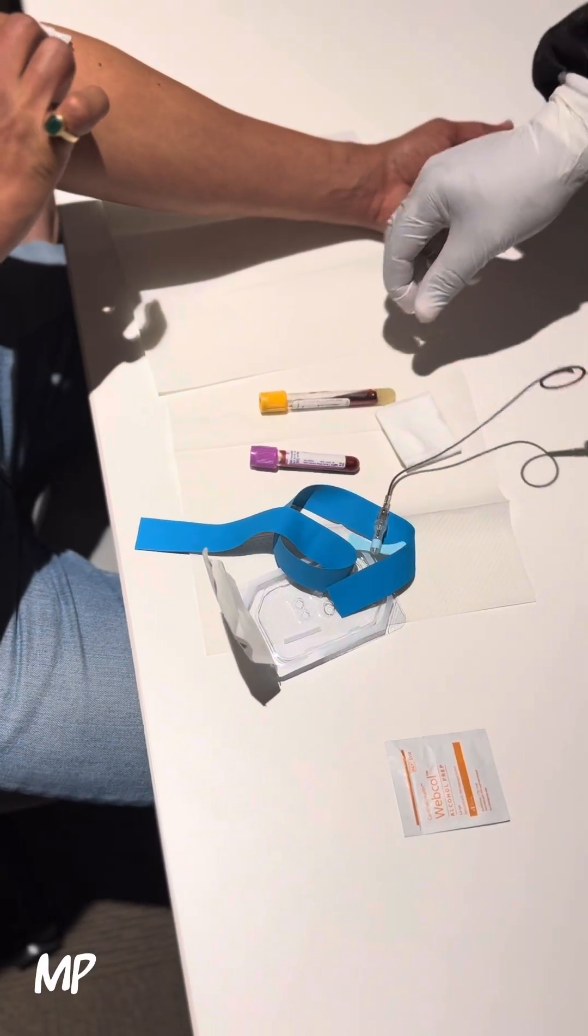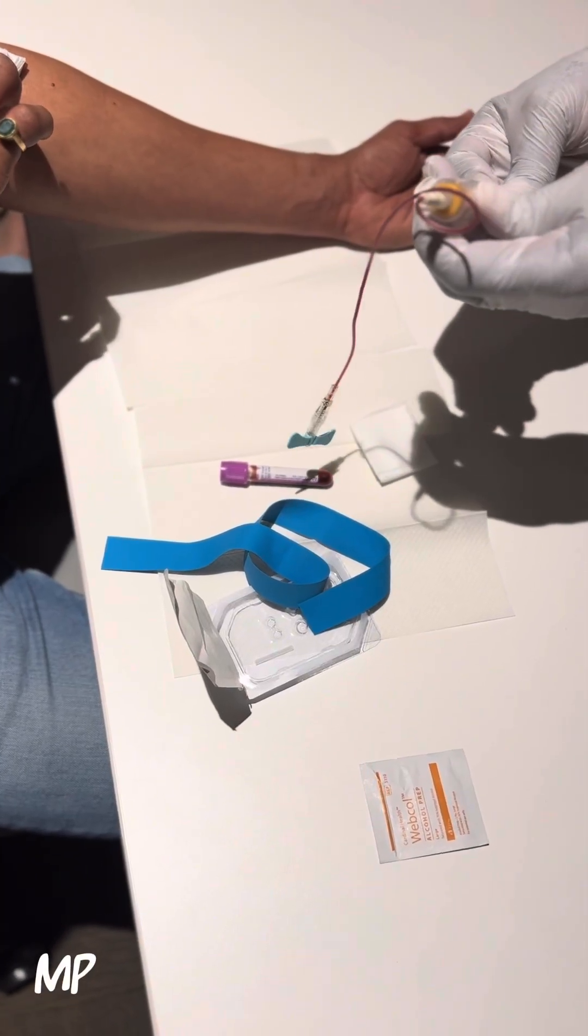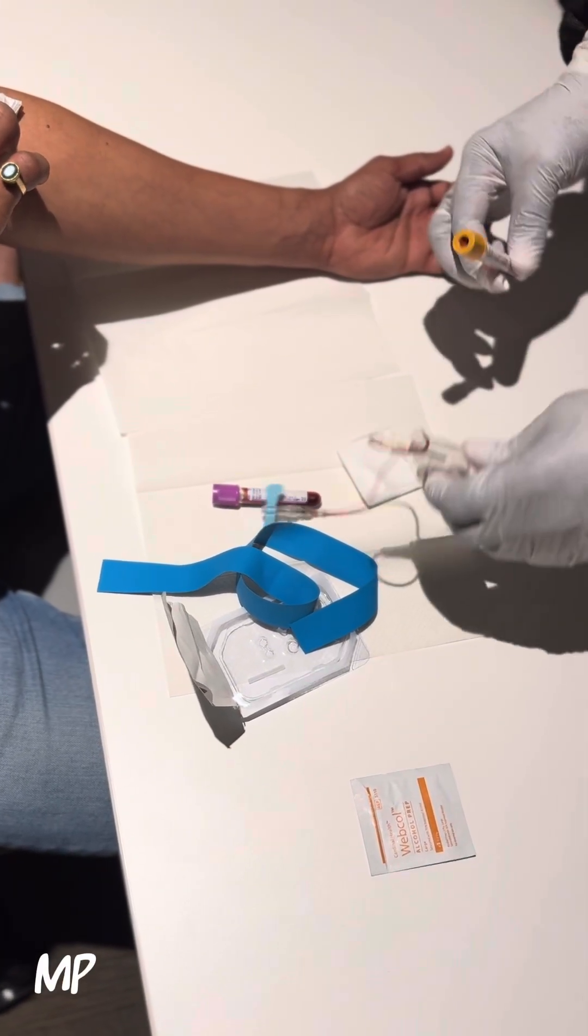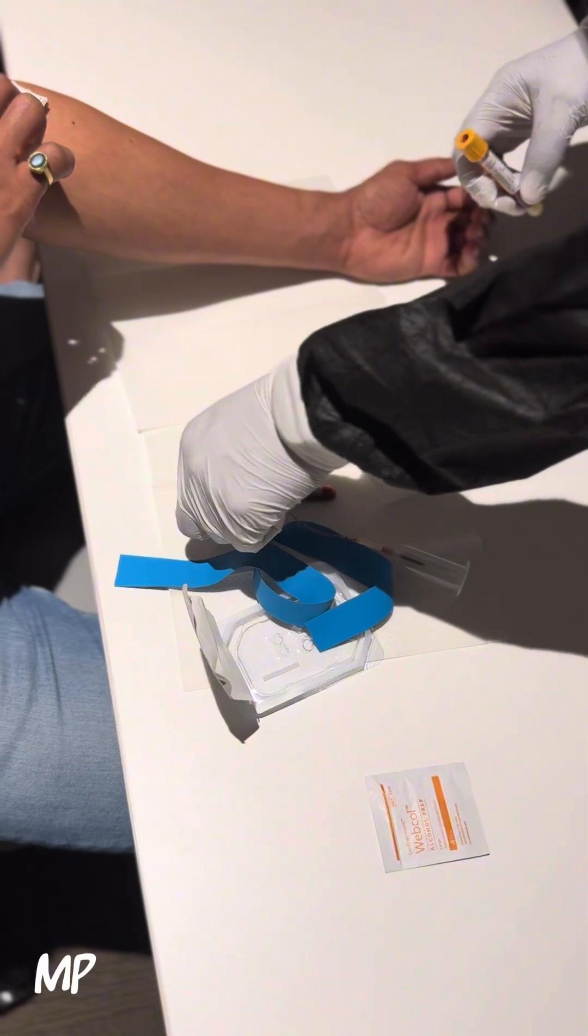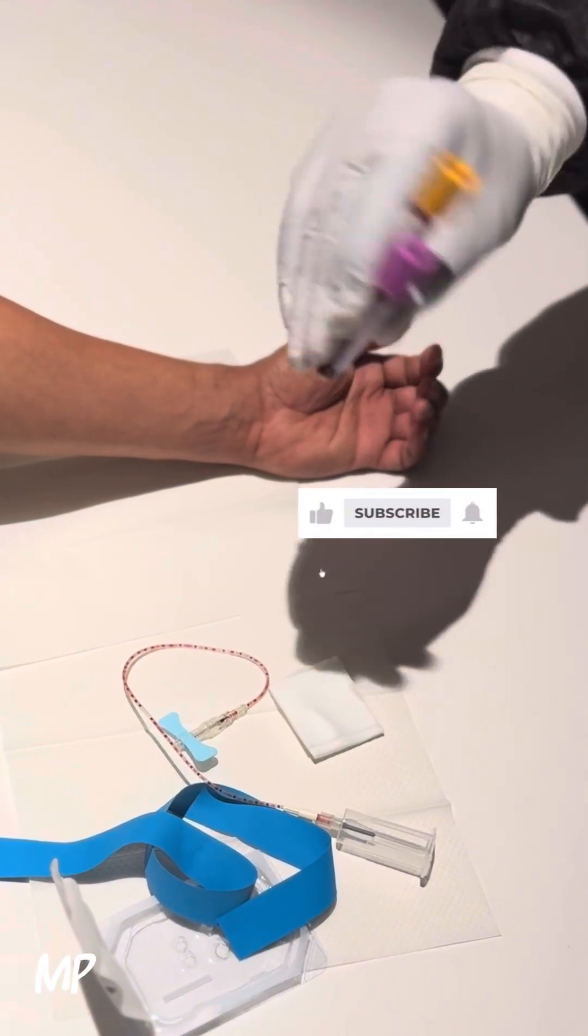If you want to purge the line, you can place your tube in, purge the excess blood, and then always remember to invert your tubes eight to ten times.